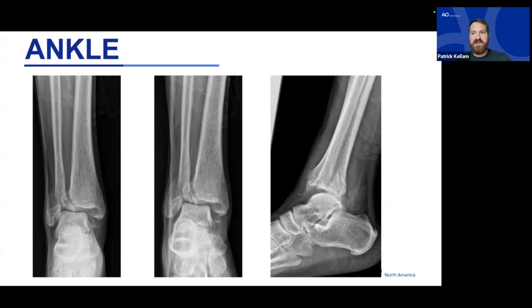I think the other thing I want to mention quickly is that when limbs are fractured and subluxated or dislocated, it can be really hard to get a perfect view of anything, right? So sometimes you'll just get images that are a pseudo AP and a pseudo lateral to get you some sense of where things are. And that's the orthogonal views. You have a 90-degree view of the limb, so that then you can make a reduction, and then you can get a more appropriate AP, mortise, and lateral if it's an ankle.